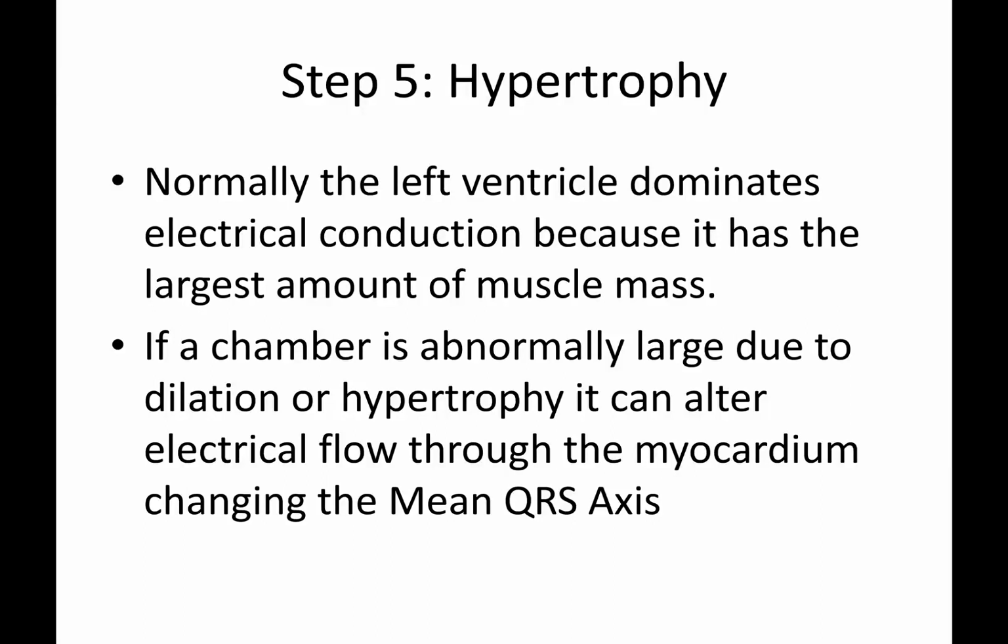Okay, so let's talk about hypertrophy. Step number 5, and of course we are doing 12 lead EKG interpretation.